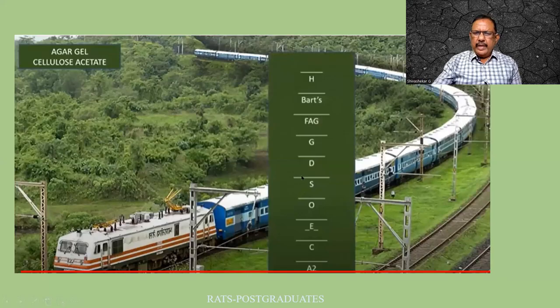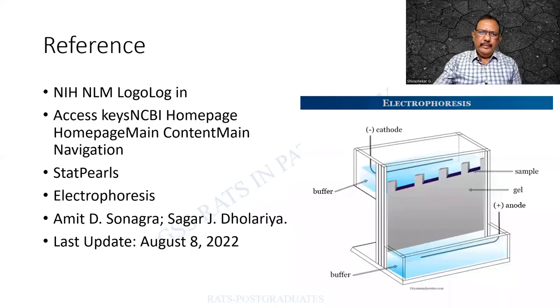That is to separate the hemoglobin S. Normally, the hemoglobin S and D are almost in a similar plane. And when we use an agar gel electrophoresis, they get separated. And this is a very useful tool in the diagnosis of sickle cell anemia. The reference for my entire presentation shall be this. I would like you people to kindly go to this reference if time permits.